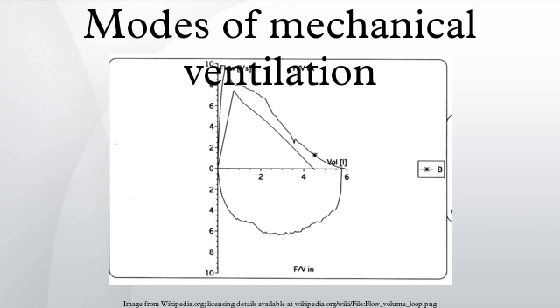Pressure-controlled. Pressure-controlled cycling is based on an applied positive pressure that is set by the clinician. In pressure-controlled modes, the tidal volume is variable, as the ventilator is using only the pressure as a measurement for cycling. Most ventilators calculate pressure at the expiratory circuit, though some measure near the circuit with a proximal pressure line.